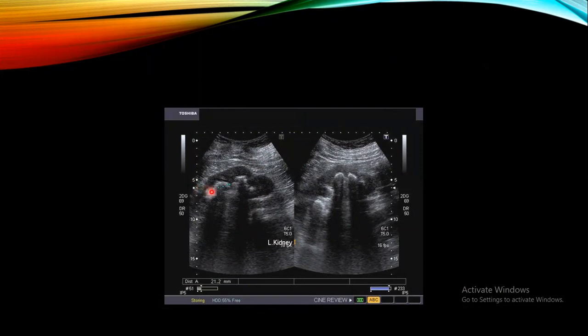Kidney. And here are multiple echogenic lesions within the kidney that fill the whole kidney. And also we see multiple acoustic shadows following the echogenic lesions. Again, this is the same kidney, but another section or another picture. We see here multiple echogenic lesions followed by acoustic shadow.